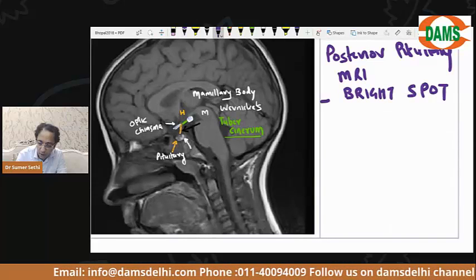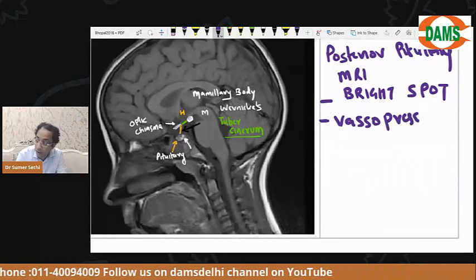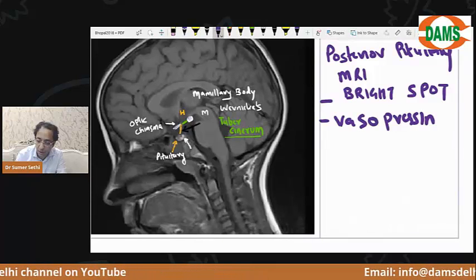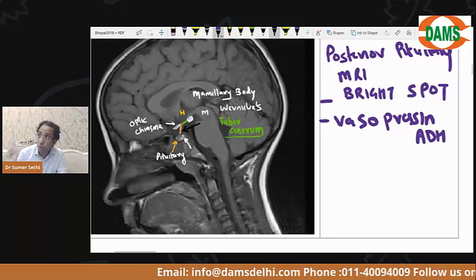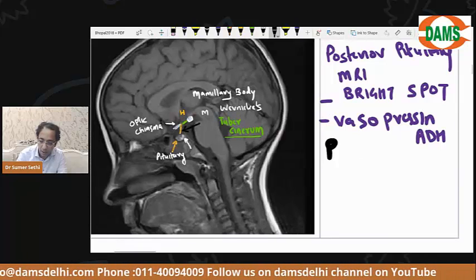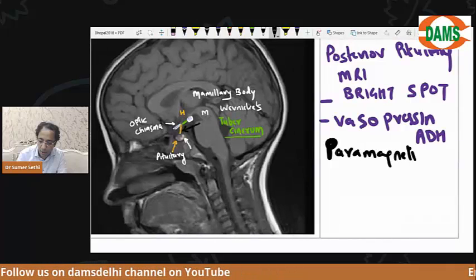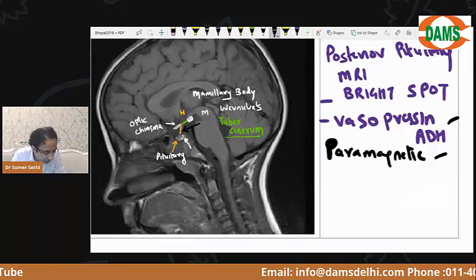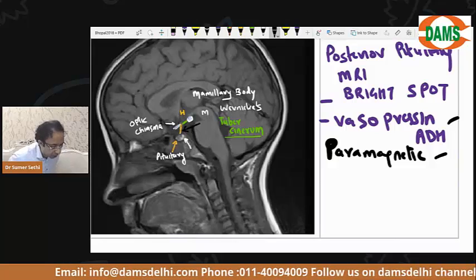Why? Because of the presence of vasopressin, which is also called ADH. Now, vasopressin has paramagnetic behavior, and that is the reason for this appearance. Okay, you should write down whatever I am writing down.